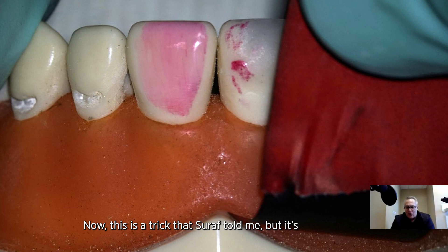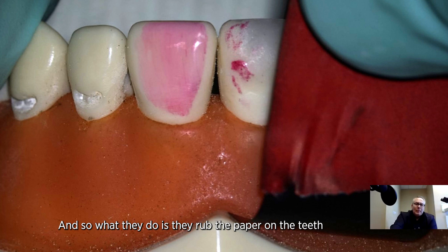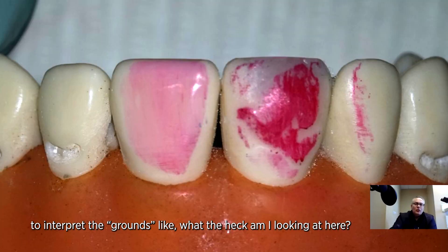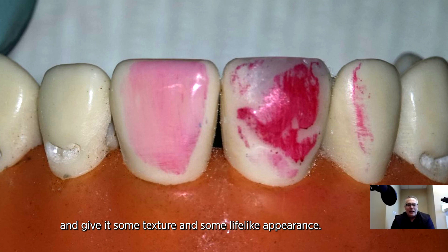This is a trick that Serhat told me, but it's certainly been around for a while, especially with technicians. What they do is rub the paper on the teeth, and now it's going to be up to you to interpret the marks — like, what am I looking at here? I want to guide you through it, and then we're going to take our mock-up and give it some texture and a lifelike appearance.